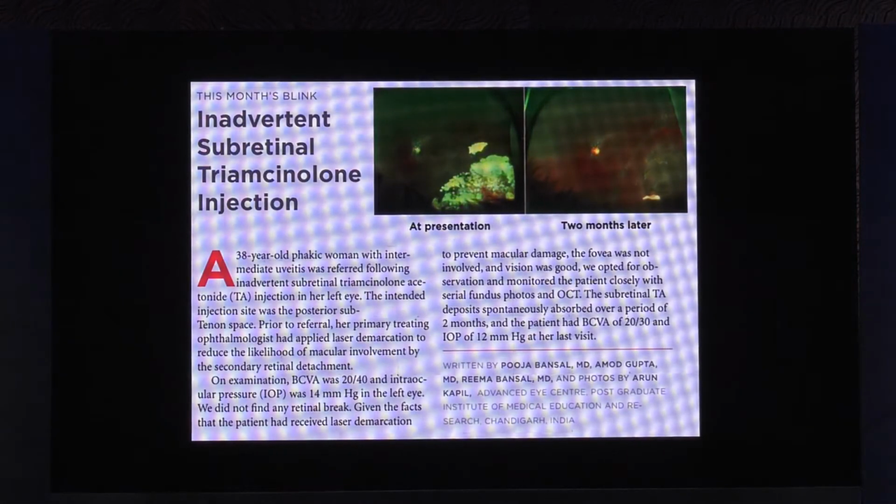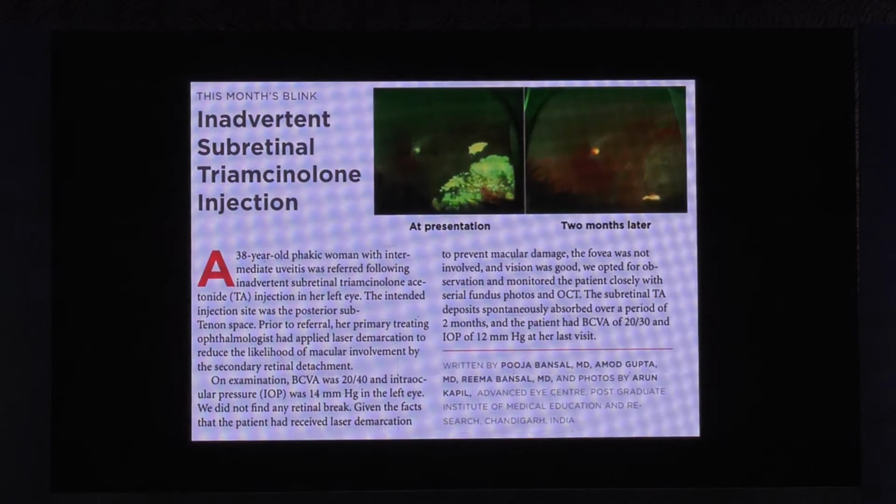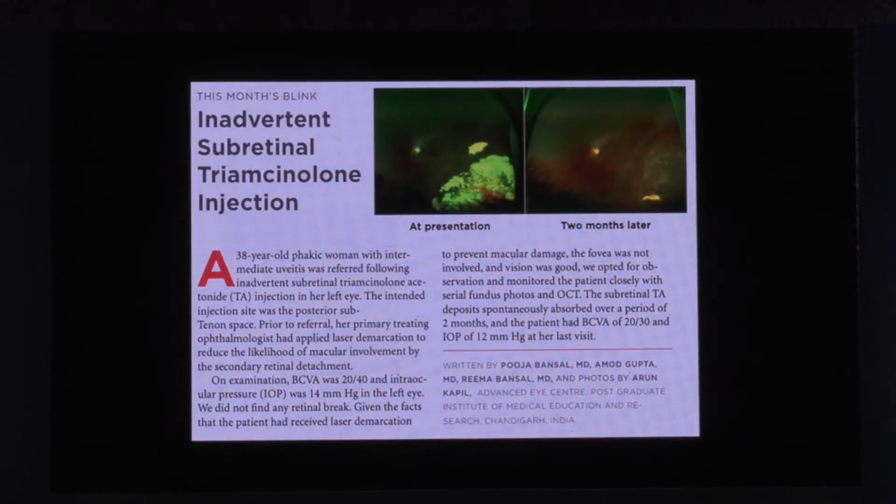This is one of our patients who was referred to us with an inadvertent subretinal triamcinolone injection. The surgeon was smart enough to detect the complication and to laser immediately and demarcate the area. When the patient came to us, we just kept her under observation, and there was no retinal detachment, and the TA deposit finally resolved on its own.